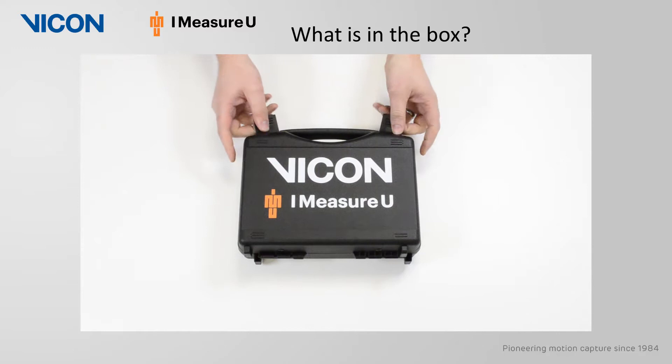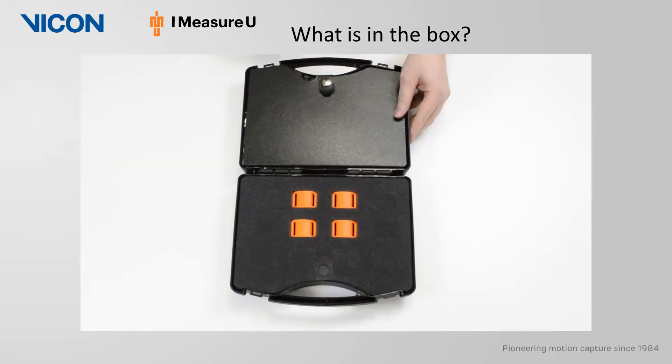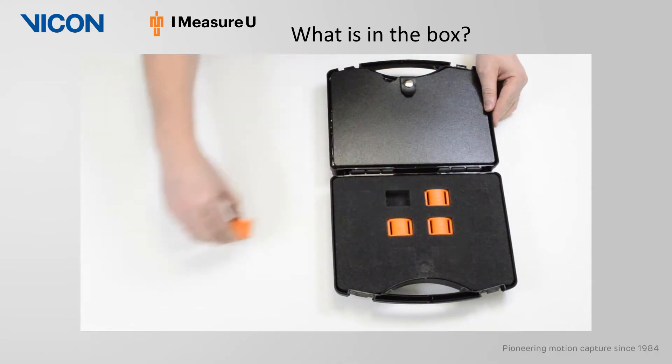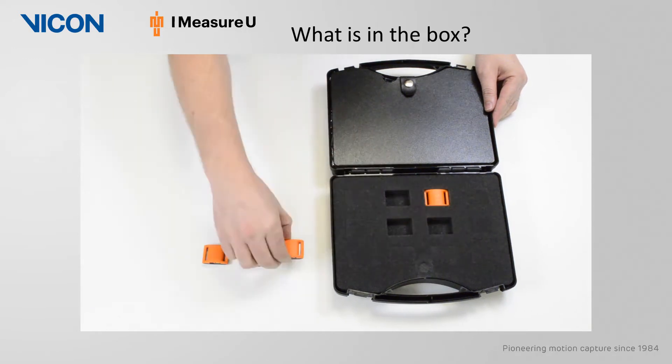The first thing you will find when you open the case are the IMUs themselves. Today we only have four IMUs; however, each case can hold up to 12 sensors, which fit nicely into the foam insert.